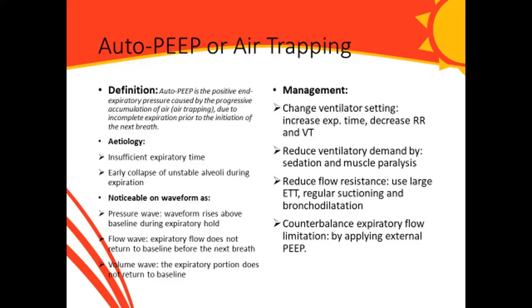So what are the causes? Insufficient time for expiration, or there could be early collapse due to unstable alveoli during expiration. Instead of waiting for air to be removed, they collapse and trap air inside. All right, so how do you notice this on your waveform?